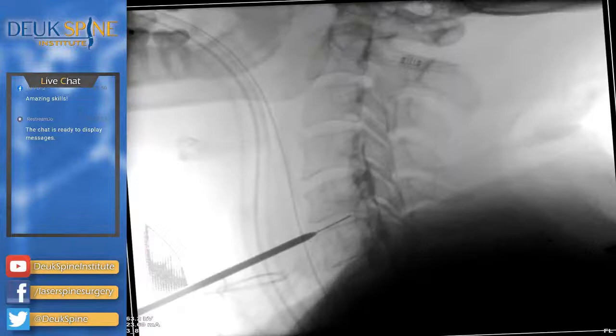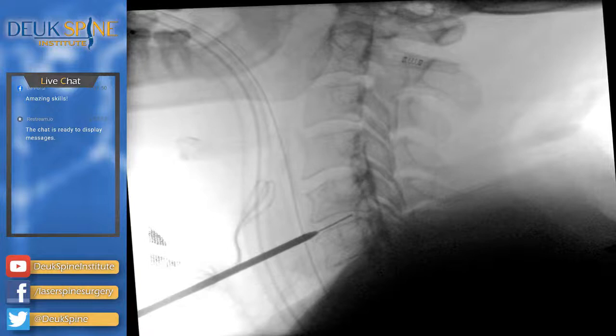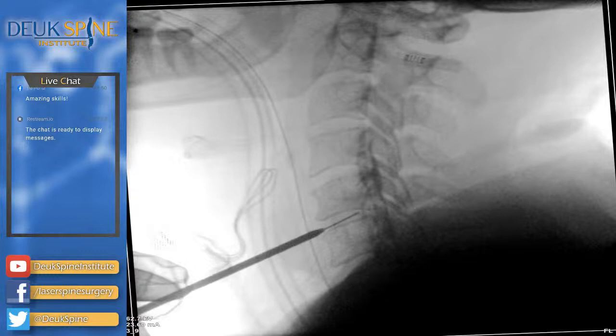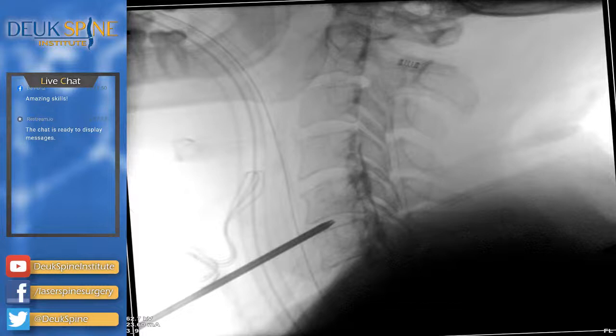Now, herniated discs can actually damage the spinal cord because they shoot out backwards right where your spinal cord is. So we're trying to avoid damage to the spinal cord by removing the herniation here. All right, I'm just gonna have to take the guide wire out. And I'm again spreading the fibers of the disc and the jelly of the disc, spreading them open.